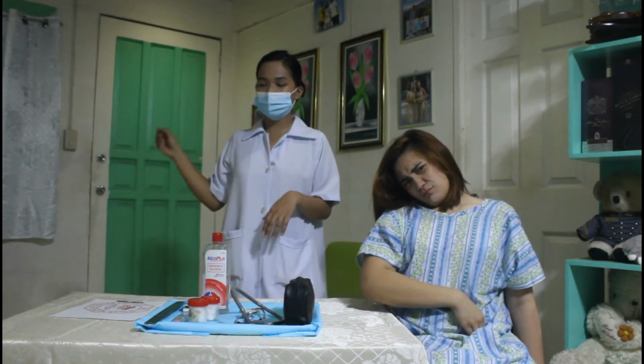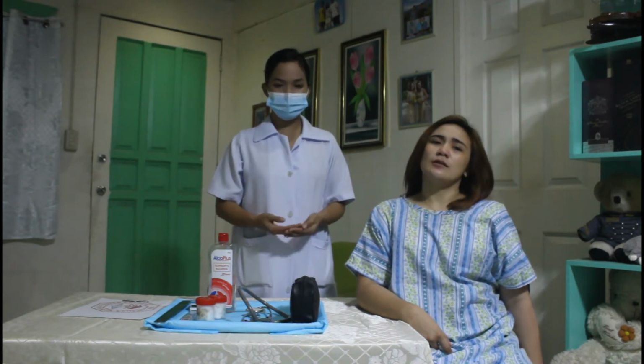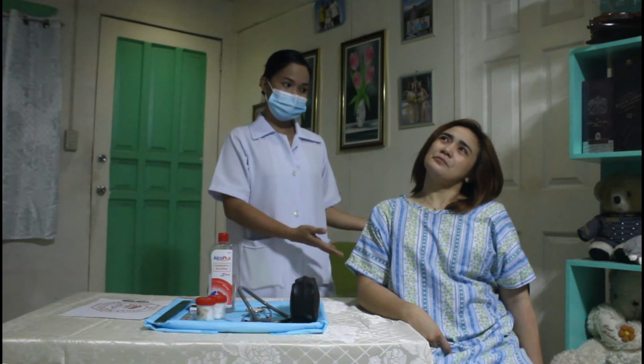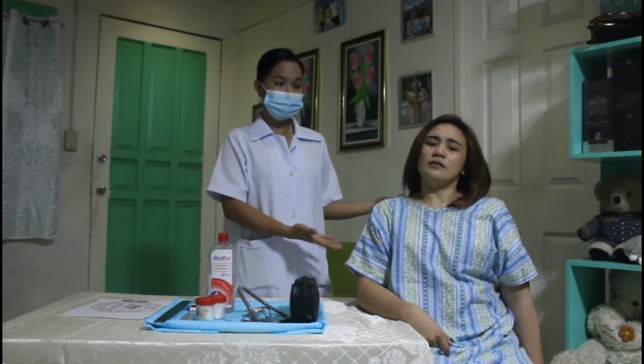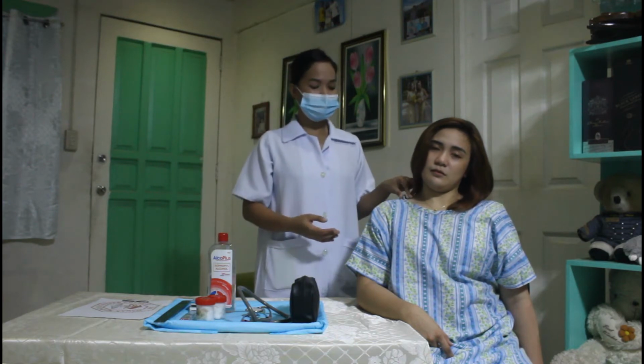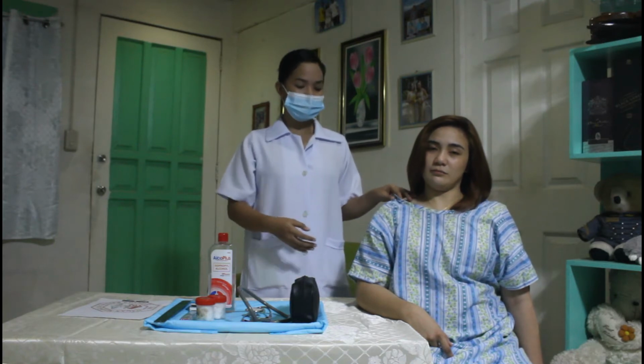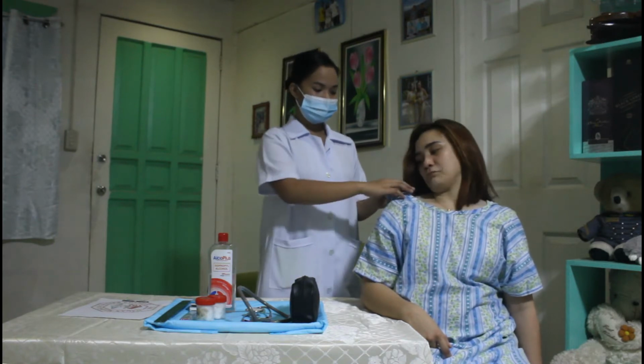And then, of course, we provide privacy to our patients. In order to provide privacy, we close the door of our patient and then close the curtain. So now, we assist our patient into a comfortable position, preferably sitting. So assuming she is on her bed, we assist her to move her clothing or gown away from her shoulder or arm.